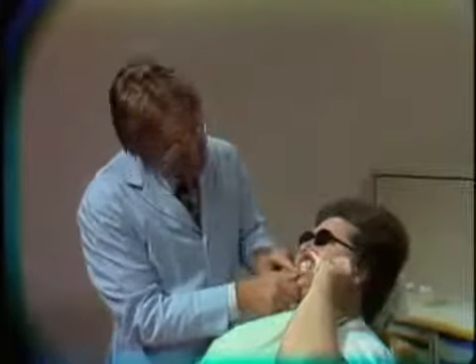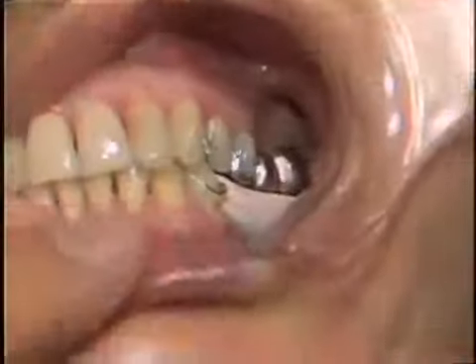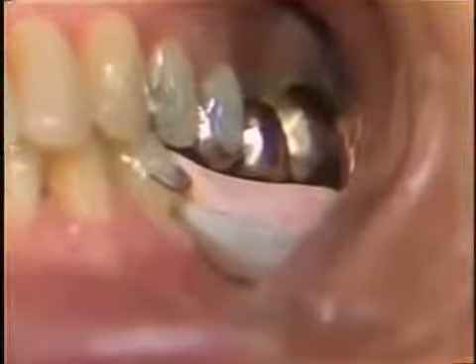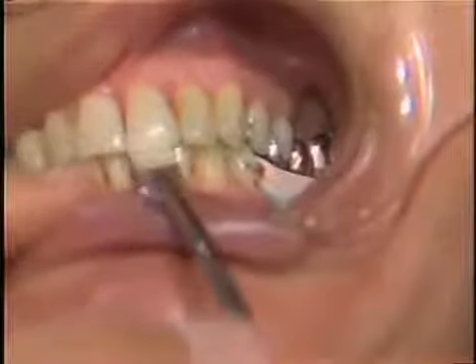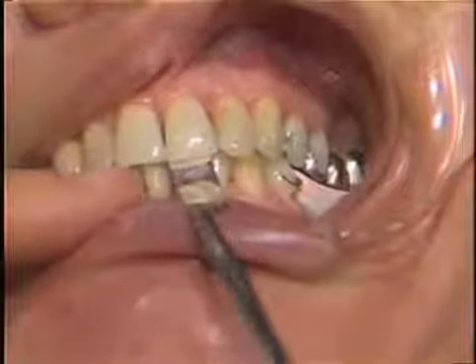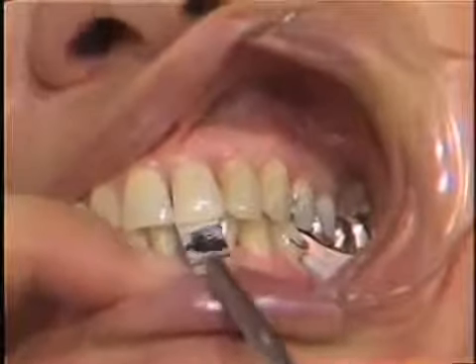Now close. And if we look closely at that, tilt your head down just a little bit, that's right. We can see that the buccal cusps are free. There are no contacts in the opposing arches on the acrylic. Maybe light contacts in the lingual area, which you can relieve. It isn't necessary that those contacts even hold shim stock. They should even be free. All right, now close down. We double check to make sure that it doesn't interfere, and we can use the shim stock as a check.